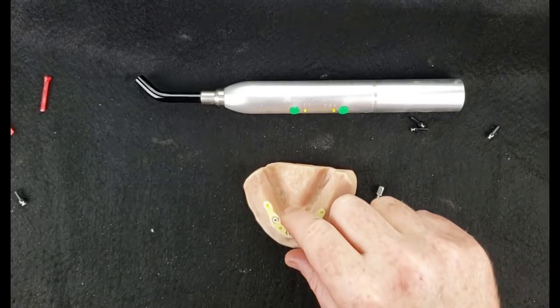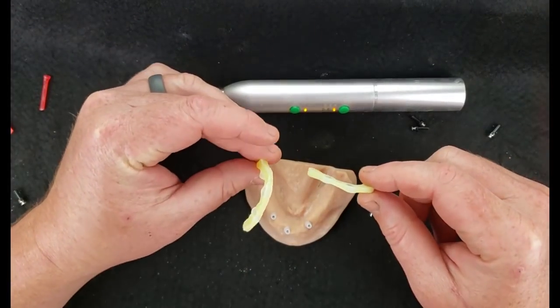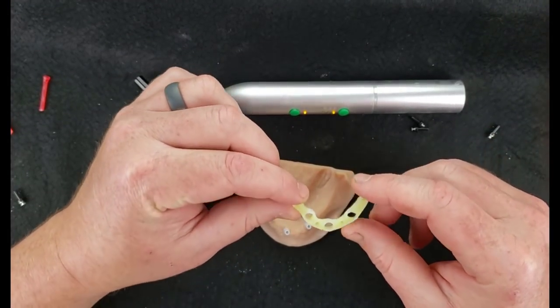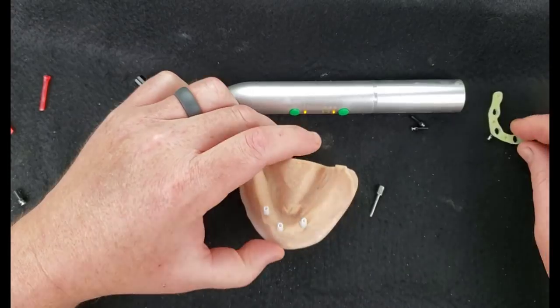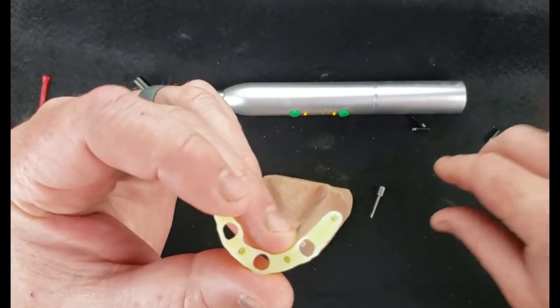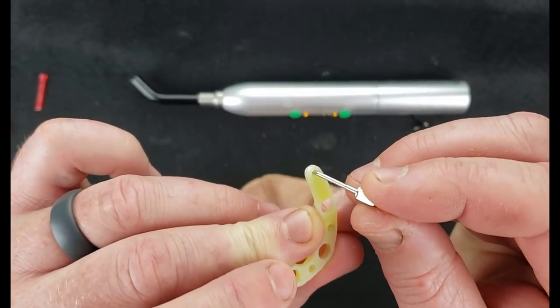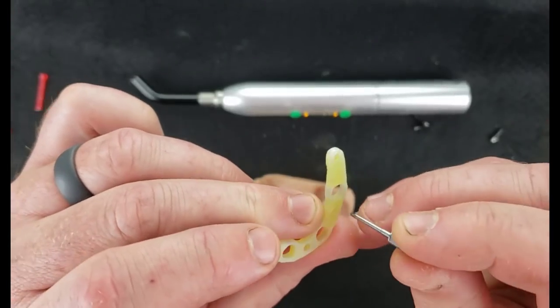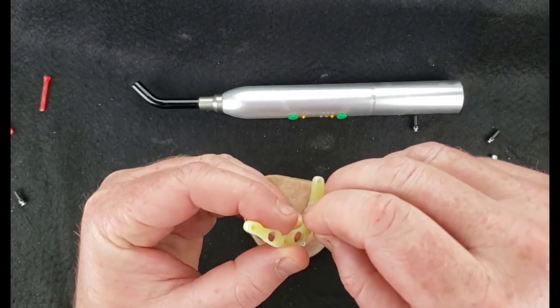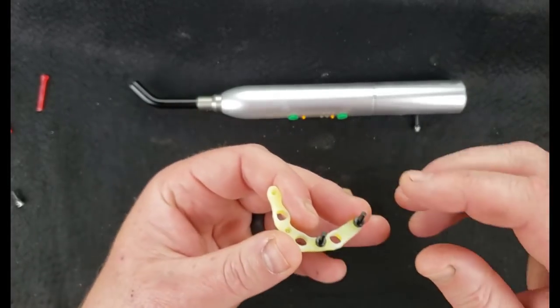Okay, so you saw the object that I designed in Meshmixer, and what I've now done is I've printed that in castable resin. I just printed up a couple of them because it's so small, it's a negligible cost in resin. You could have just as easily waxed this up by hand. This just saved me some work, and by creating these little pickup holes for the Locator cast 2 abutments that I've made, this is going to enable those to sit in here perfectly parallel. I would have just had to do that by hand, but you can absolutely do this by hand if you want. It's totally up to you.